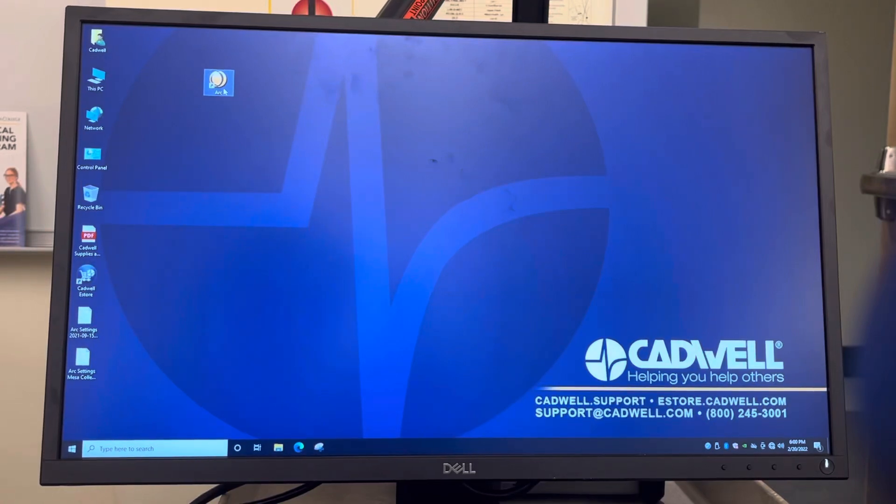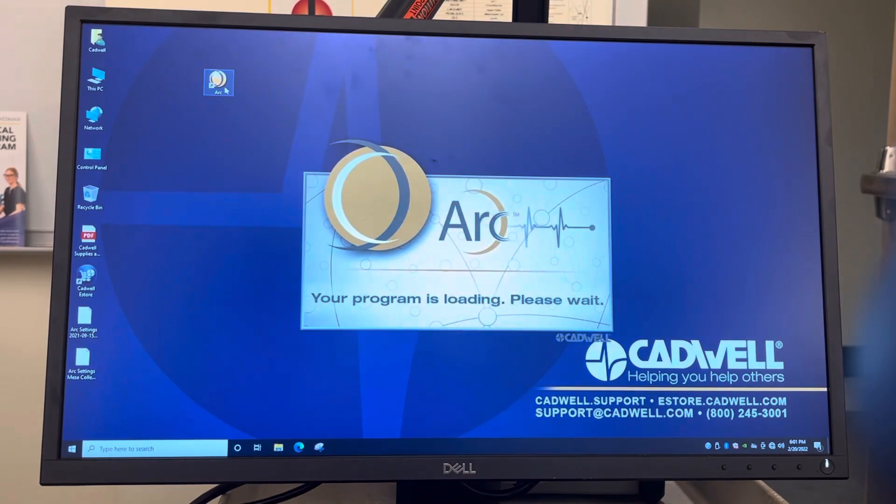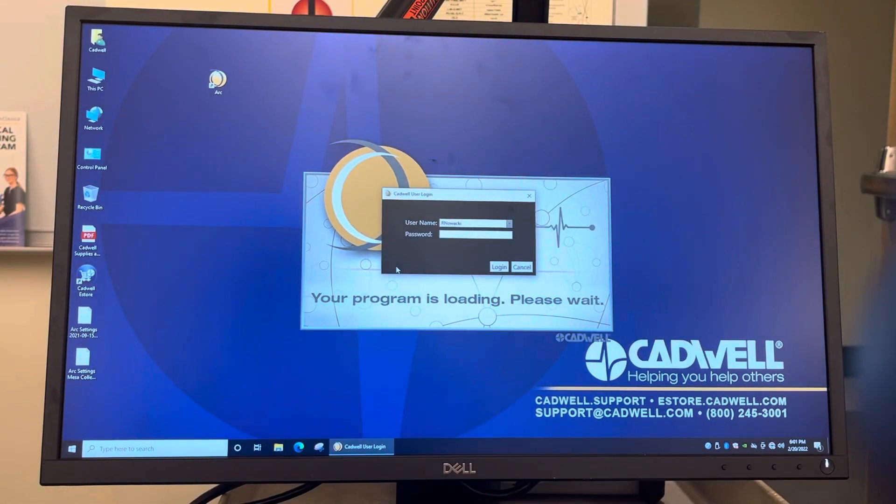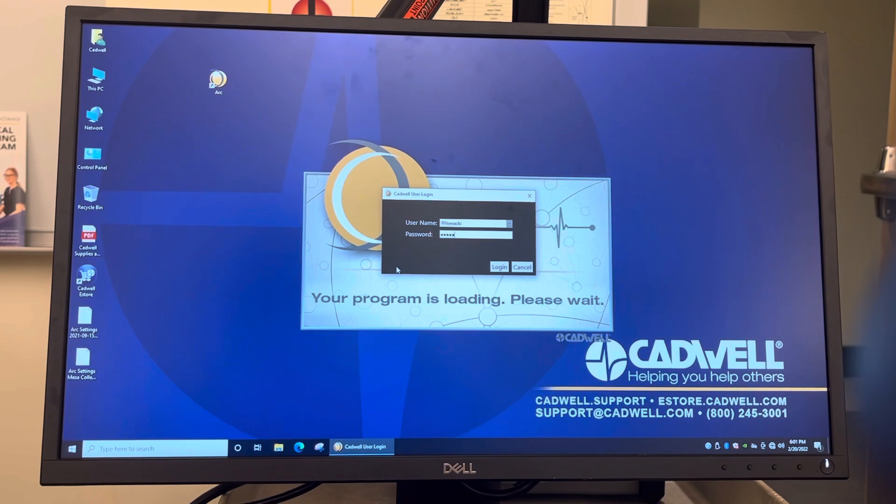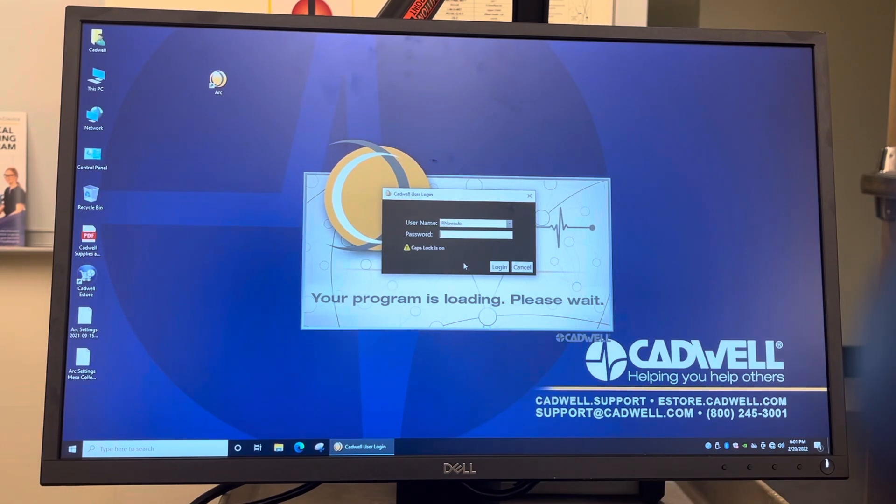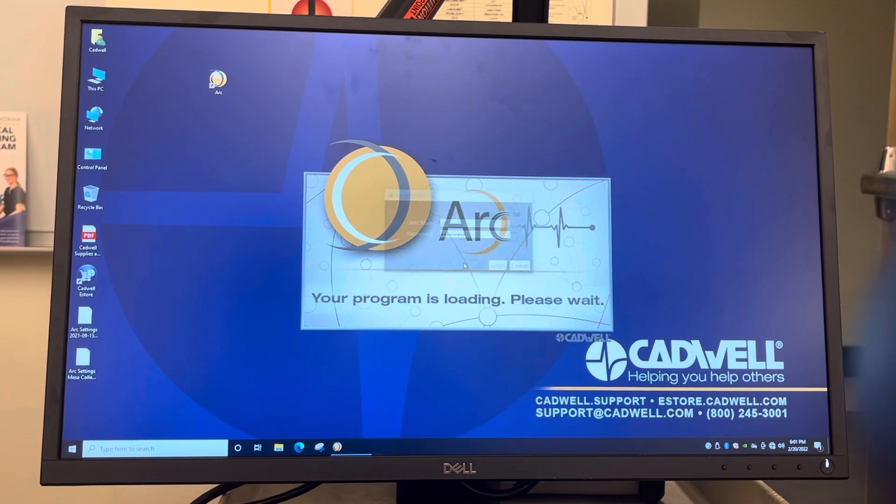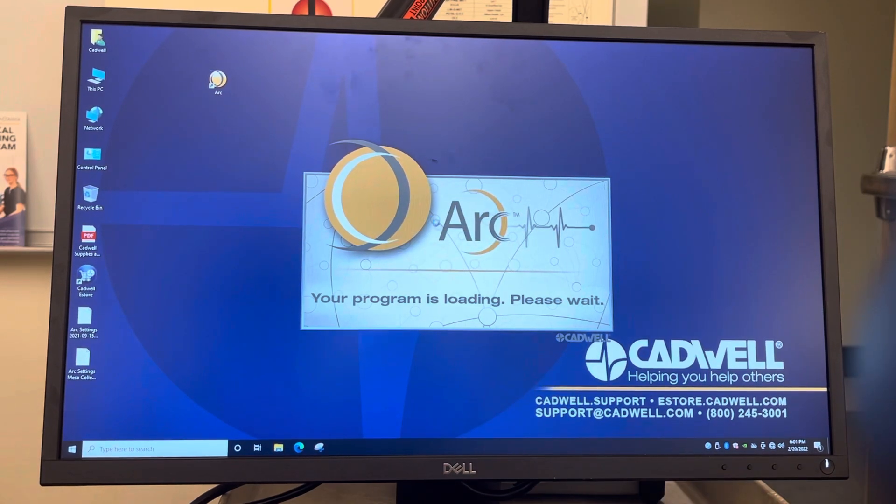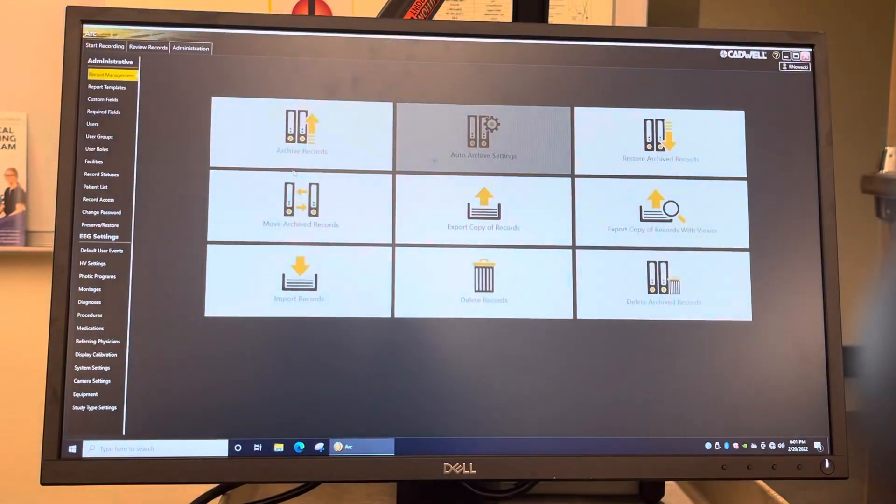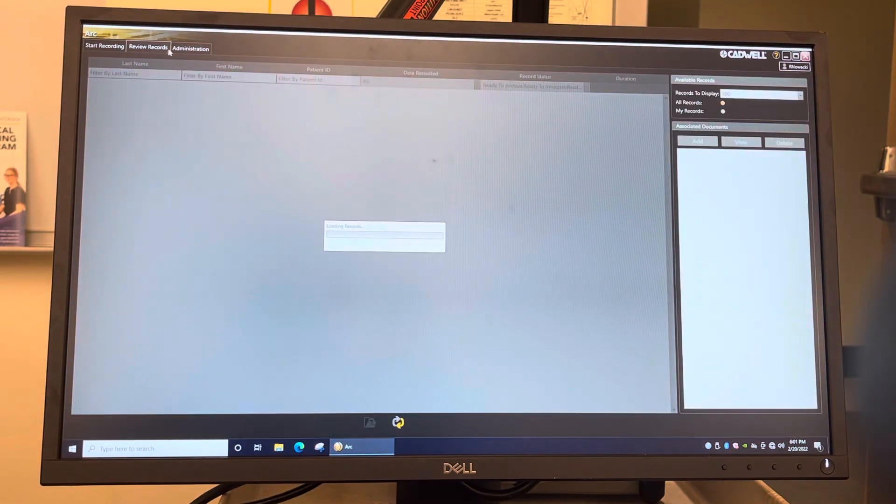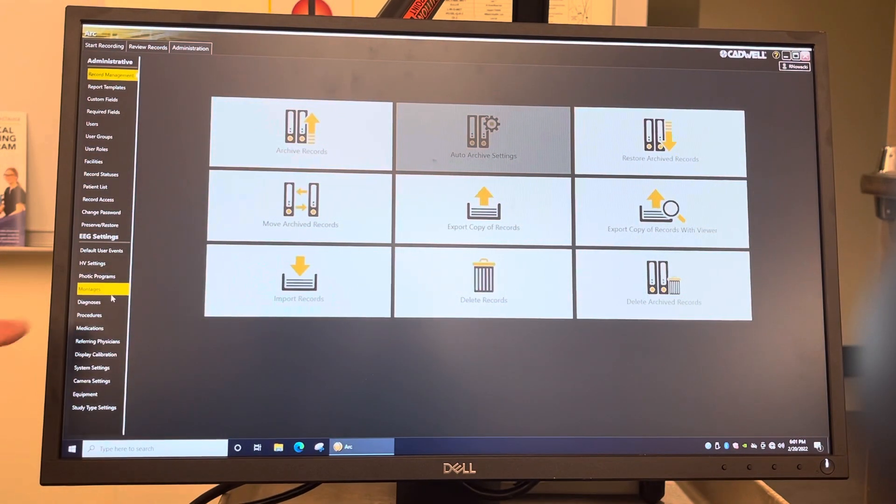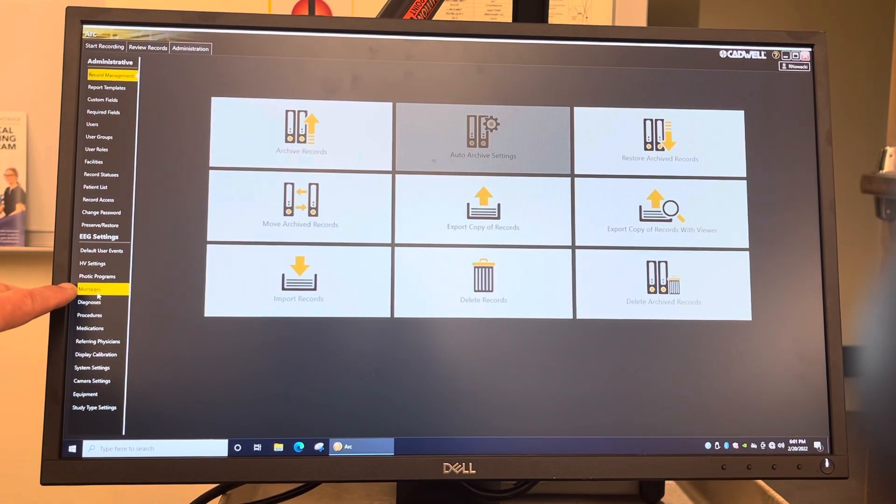Okay, we're going to create a montage for Cadwell. So you just log in. We'll log in here. So you want to go to administration, and then you go down here to montages right here.